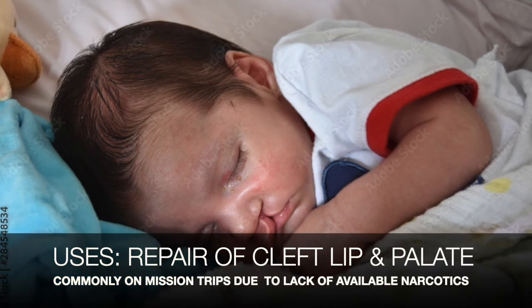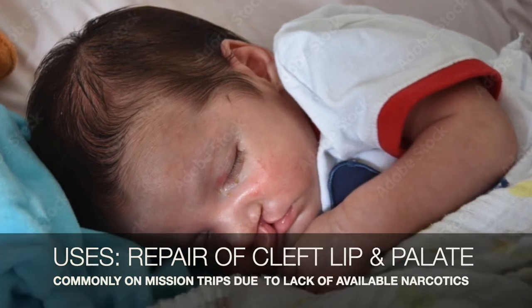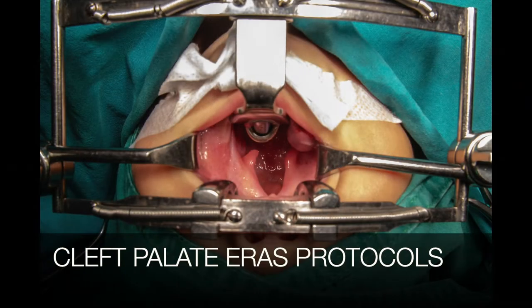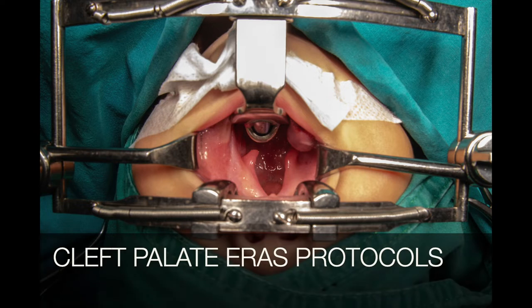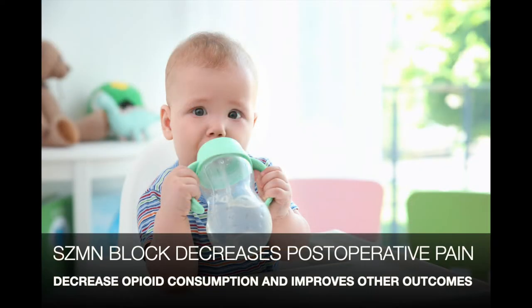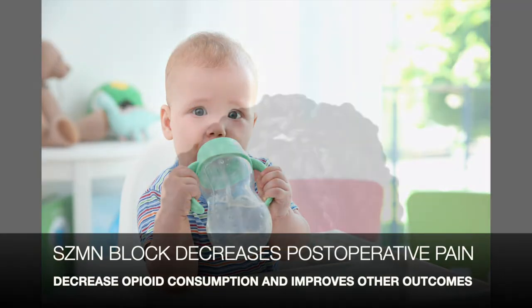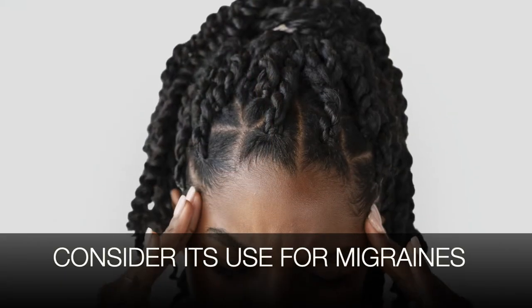This block is used for the repair of cleft lip and palate and can be incorporated in ERAS protocols. The goal is to decrease post-operative pain. The pterygopalatine block is also used for migraines.